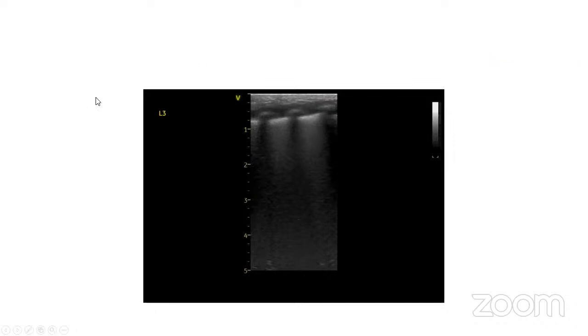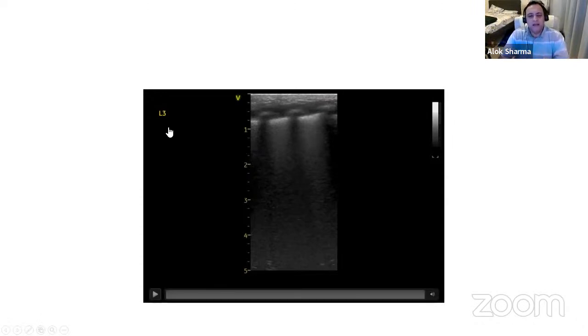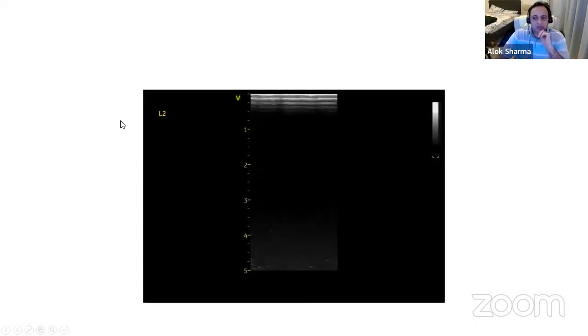So again, my only comment at this particular point is because of the frequency, I just wonder whether we might not be interpreting subpleural consolidations as well as we should be. So my advice would be really important: play with your probe. Yesterday, one of my colleagues at the Corniche who's learning and I had a nice play with the probe where we discussed image optimization. So don't hesitate to use your linear probe. Start with the highest frequency and look at what your image quality really looks like. But my gut feeling is your gain settings also have to go up. But well done. Thank you.